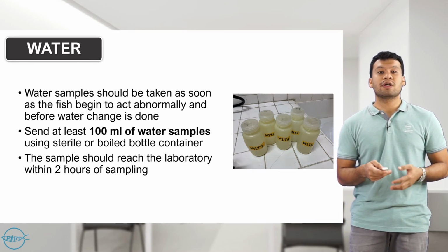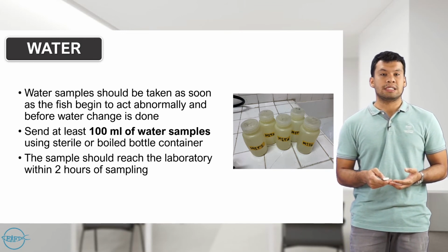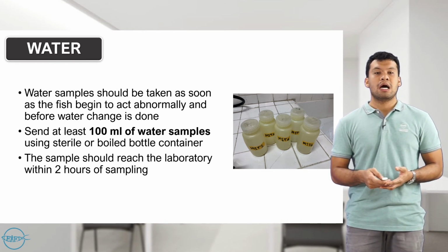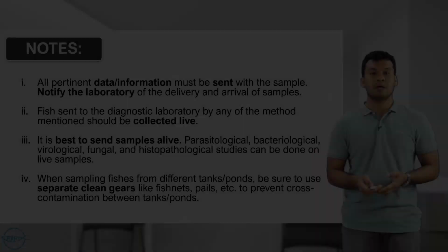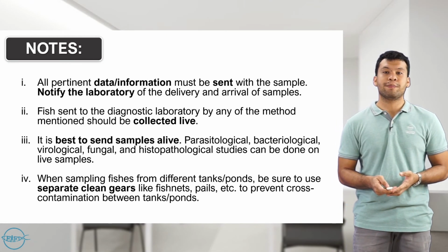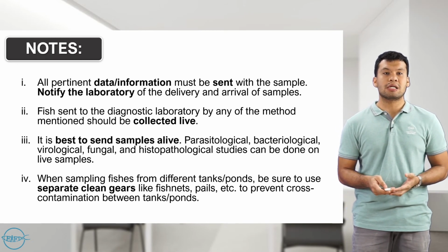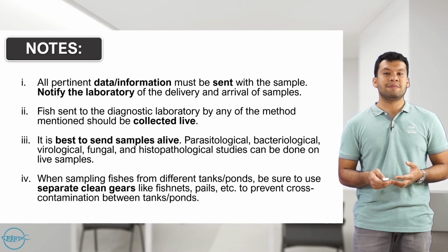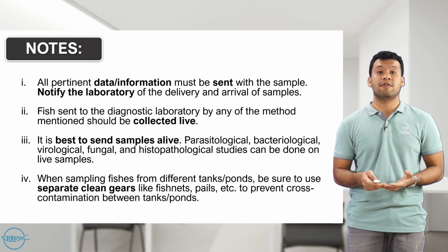And then right after, you can put the right amount of water sample you'll be needing for the diagnosis. Always remember that the sample should reach the laboratory within 2 hours of your sampling. These are some of the important notes that you need to remember upon sending your samples to the laboratory. All pertinent data and information must be sent to the laboratory, and you need to at least notify the laboratory of the delivery and arrival of the samples.